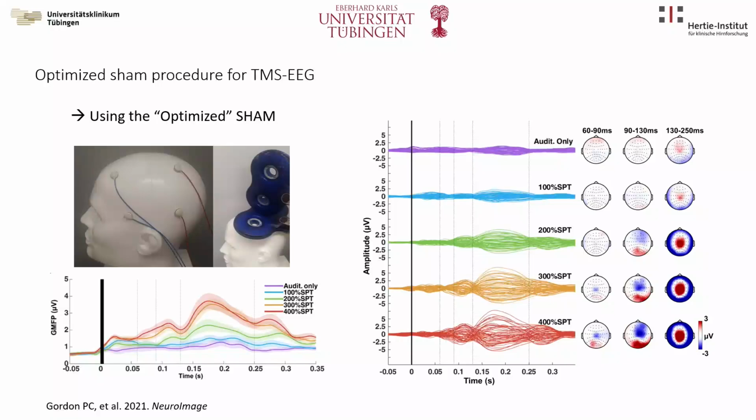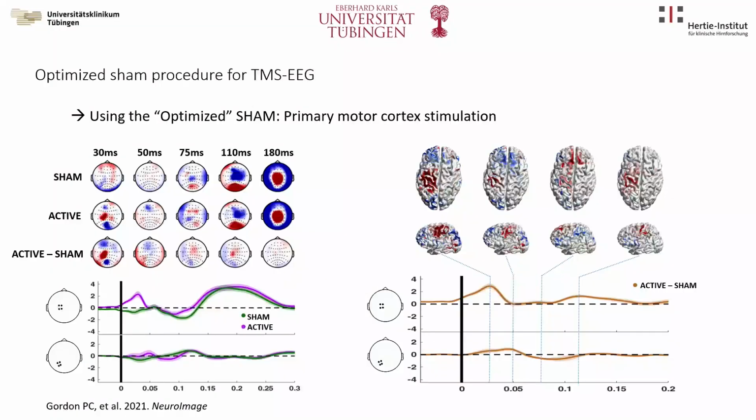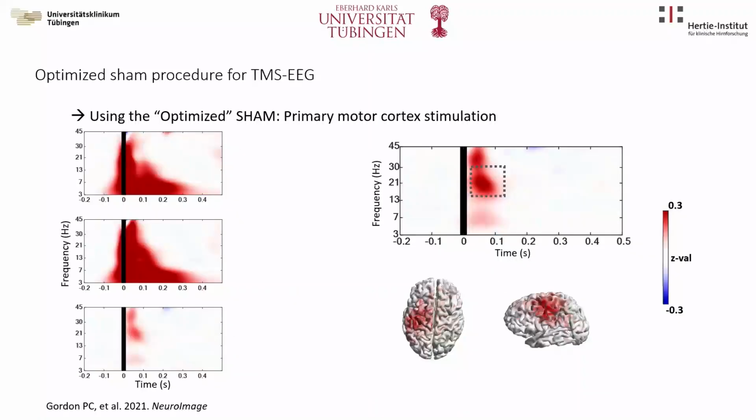All right, so if I take this intensity and this overall setup, when I use high sham intensity in both real and sham, I can then stimulate the primary motor cortex and get your usual N100, P200. But then, if I subtract both, I would get something that can only be attributed to the direct cortical stimulation. And as Sylvia suggested, it's a very early potential. And you can even see something in the area that's supposed to be occluded by the sensory evoked potential.